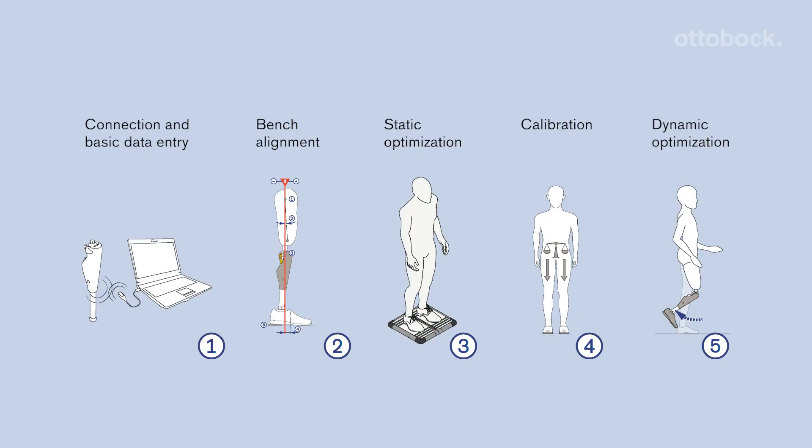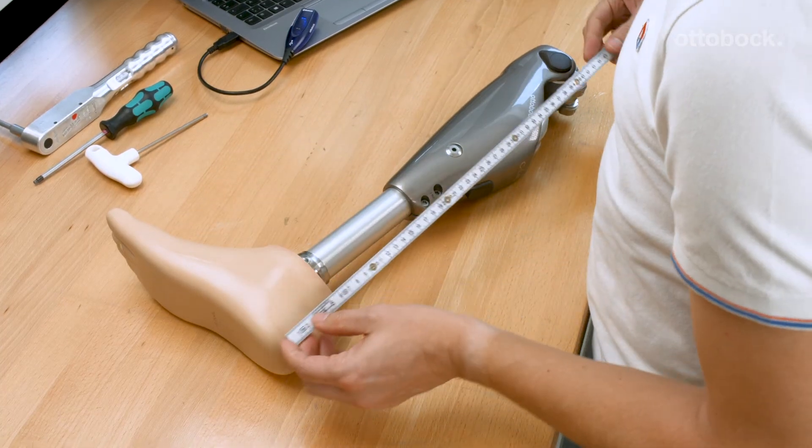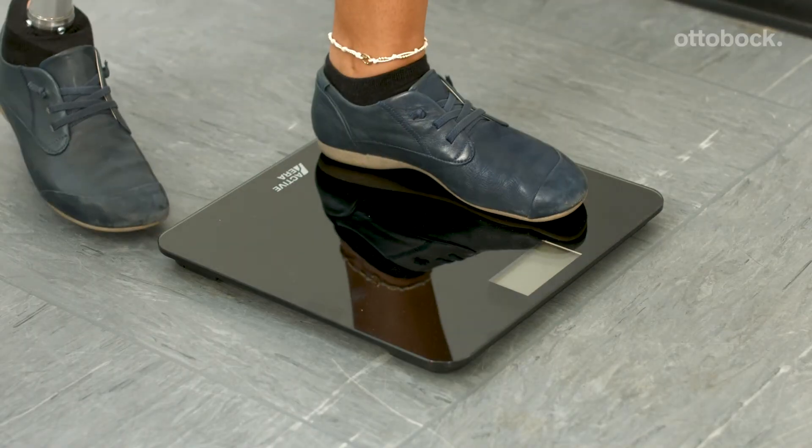Follow the recommended alignment and setup process for the SeaLake 4 to achieve the best result for your user. To ensure that the SeaLake 4 will release into swing phase, measure the knee centered floor distance without shoe and the body weight with prosthesis.